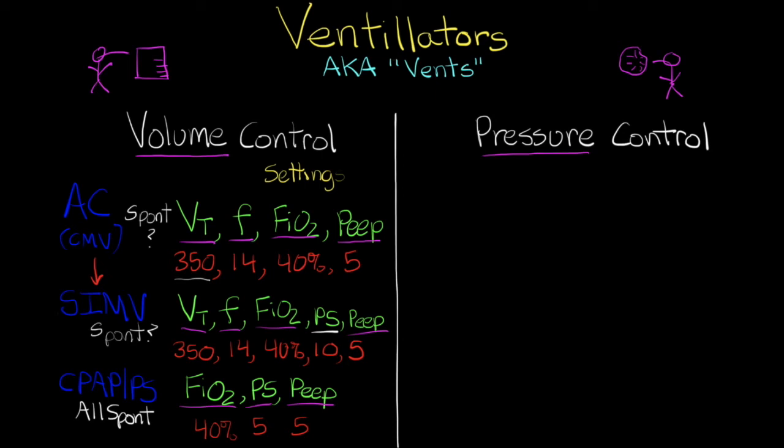If you remember when I was just talking about pressure support, I was saying typically the lowest that we will go is 10. There is an exception to this, and this is when we are doing an actual spontaneous breathing trial for our patient. For the point of this lesson, I'm not going to go into the different criteria that we use to do spontaneous breathing trials and the things we look at for extubating our patients, but I do want you to know that if we are doing a spontaneous breathing trial, we will drop the pressure support down to 5.